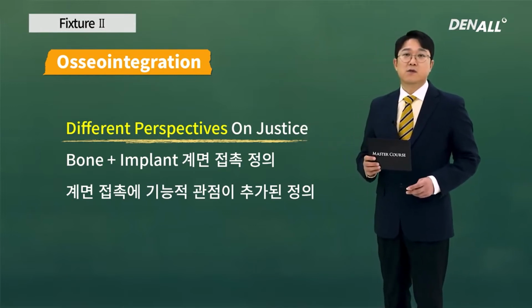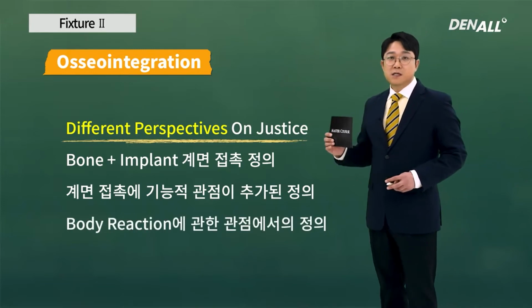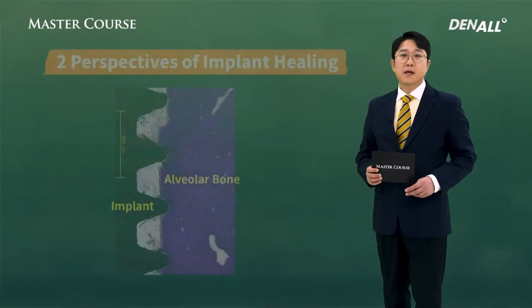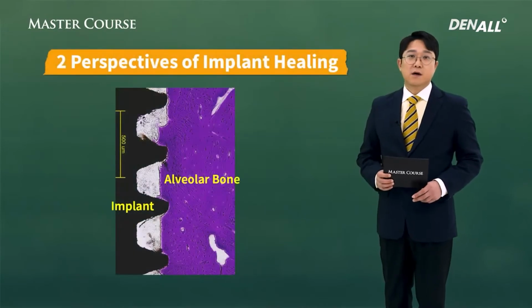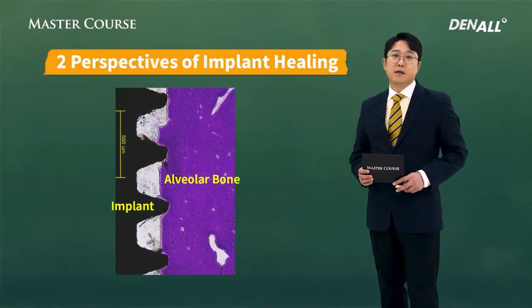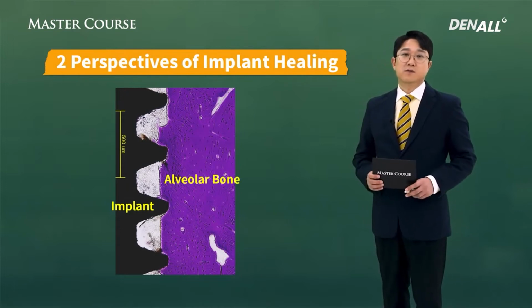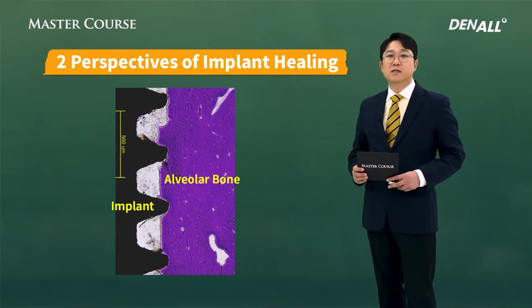Professor Albrektsson defined it from the body reaction perspective. Whatever definitions are used, there are two perspectives of explaining when it comes to the implant healing.